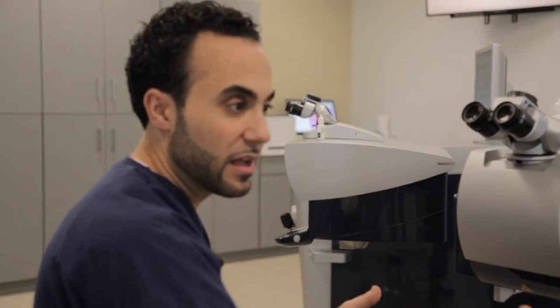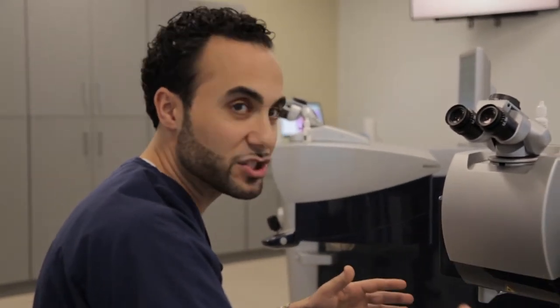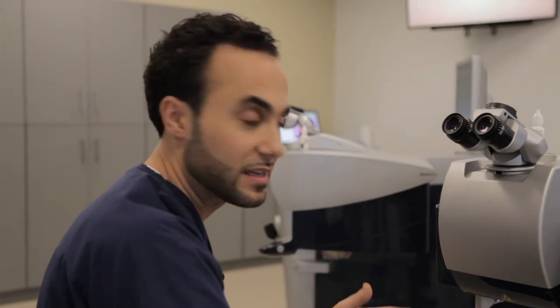We do this on each eye — it takes only about three or four minutes. Then we swivel Daniel right over to the second laser, referred to as the excimer treatment. This is where the real magic happens — this is what actually erases the patient's need for distance glasses. This side takes about three to six minutes, so the whole procedure really is within ten minutes.